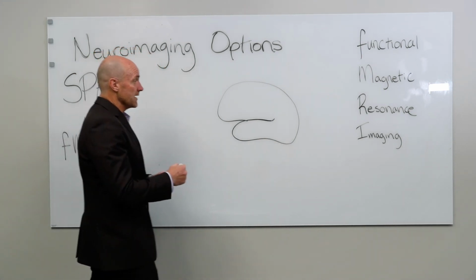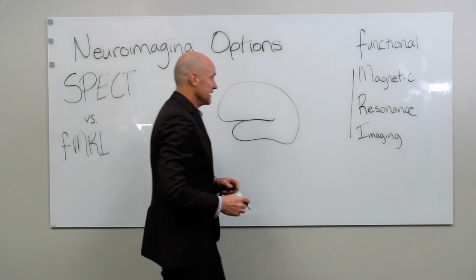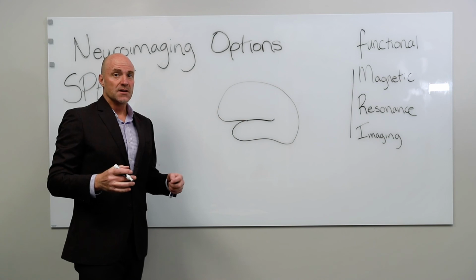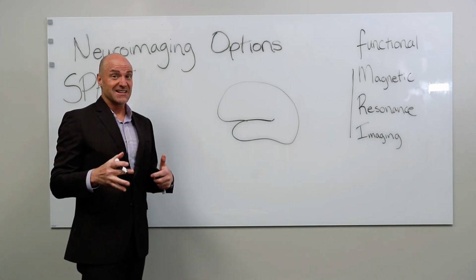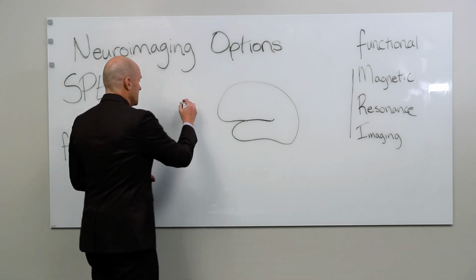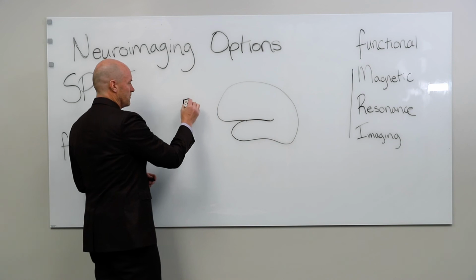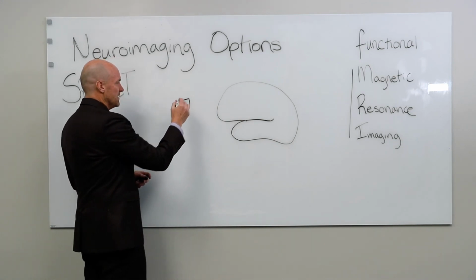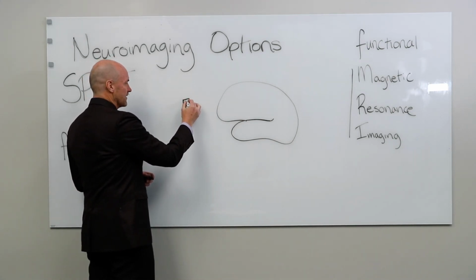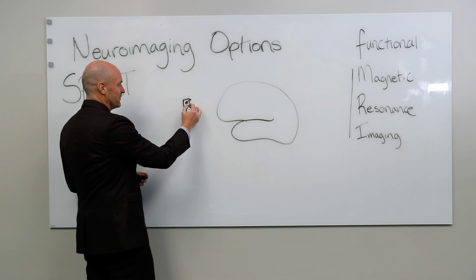In MRI imaging in general, the technique works as follows. You have magnets and radios, basically those two elements. And so you have some tissue in the body, so this little bit of body tissue, and it gets magnetized. And so I'm going to use this little symbol to represent magnetization of that little bit of tissue.